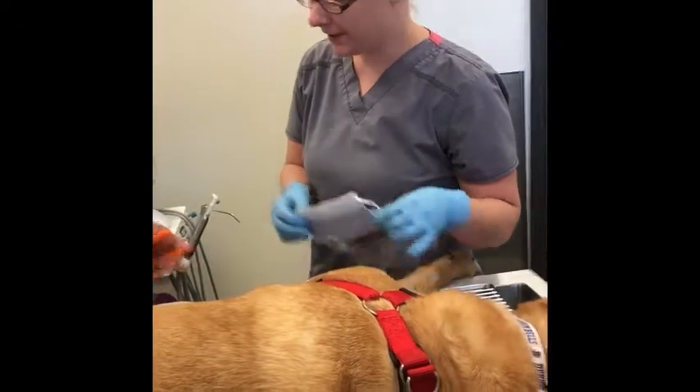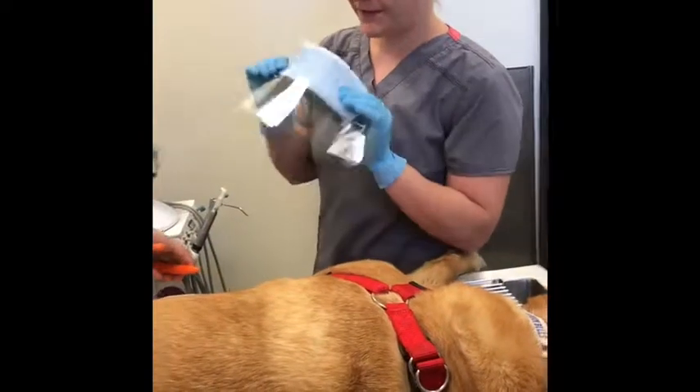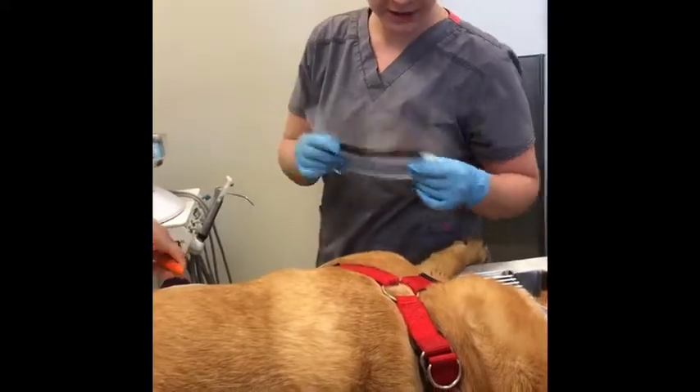All right, so we're going to go ahead and do our dental today. We went ahead and put on our protective gear. We have our gloves, our mask, and our face shield.